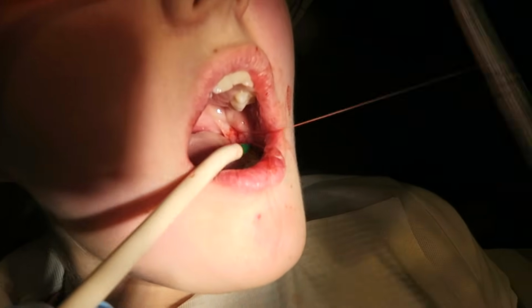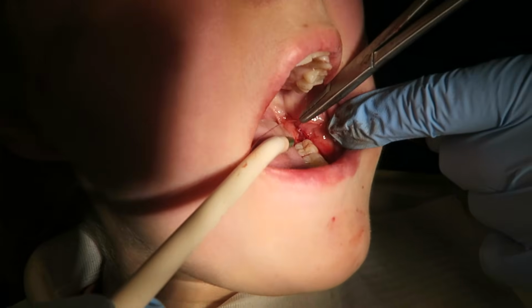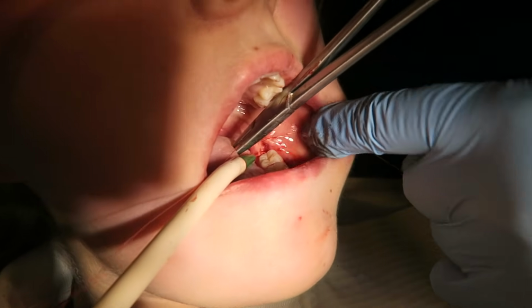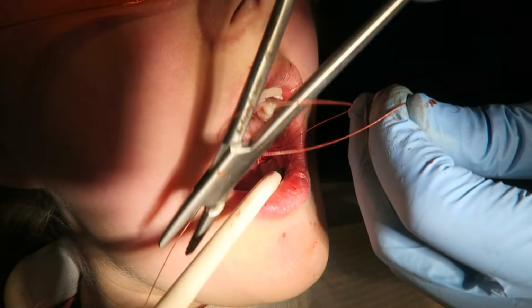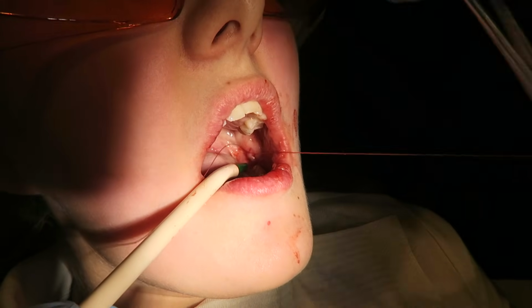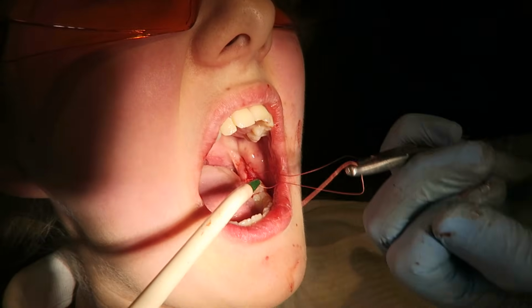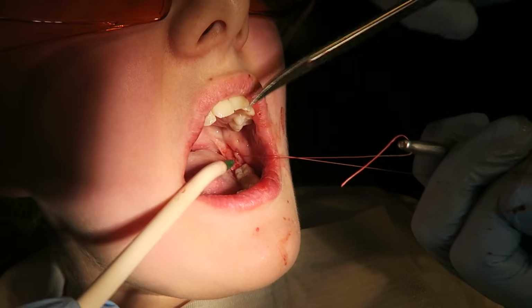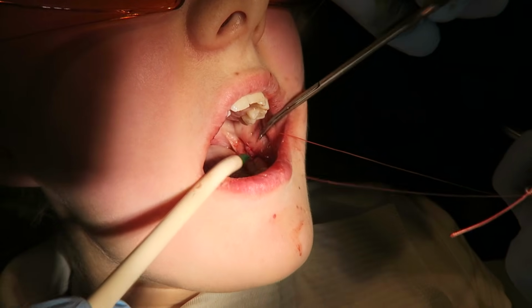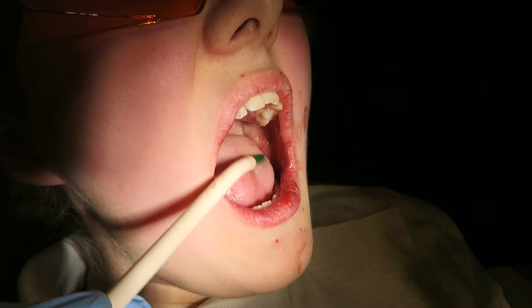So another stitch along the external oblique ridge, again interrupted. I use 2 throws to start with, and then 1 throw in the opposite direction, and the last one will be opposite to the previous one, but only 1 throw. So make sure the stitches are stable. As you can see, the first stitch I placed has become loose, so I've taken it out.